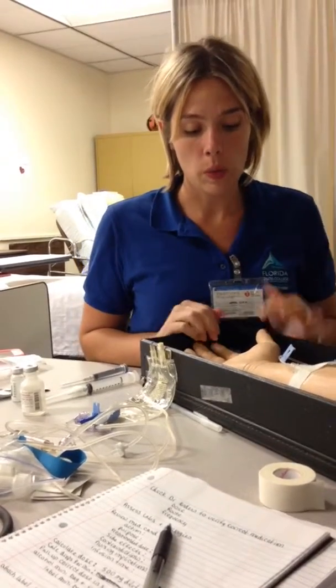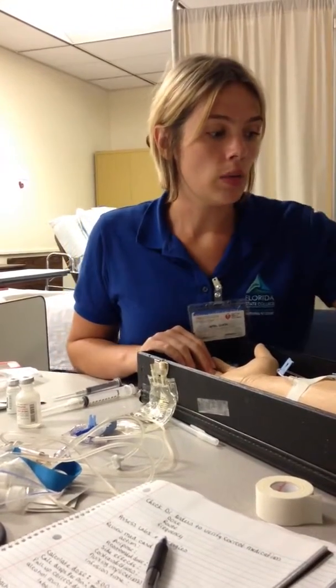I am going to simulate administering IV medication via a mini bag. For my patient, I have checked the physician order. The physician has ordered Flagyl. This patient has no allergies to food or medication and is here for an infection. Flagyl is an antibiotic, and so this medication makes sense for my patient.